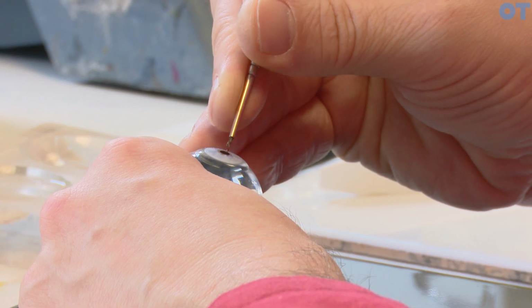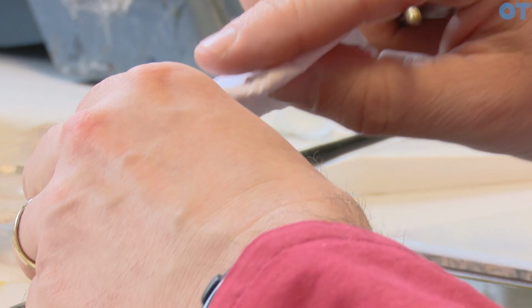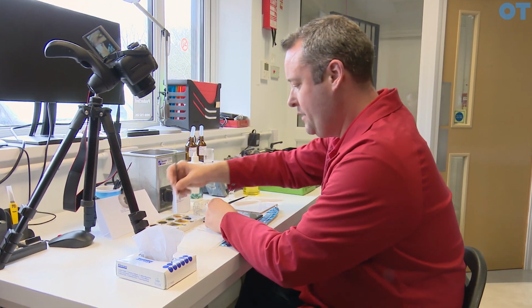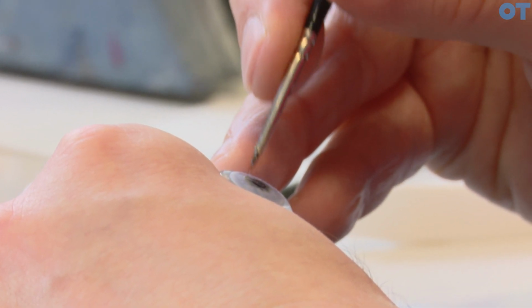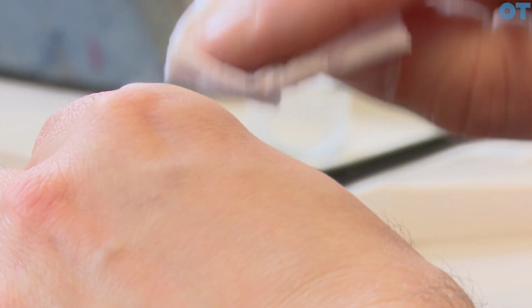From start to finish, you're probably looking at around about an hour from prepping it to painting it, and then curing it, heating up the lens and then going back to it, and then painting it, finishing it off. Yeah, it's probably about an hour. But then all the lenses are different, so some you might paint quicker than others. Then obviously if it doesn't turn out how you want it to, you've got to start again from scratch.